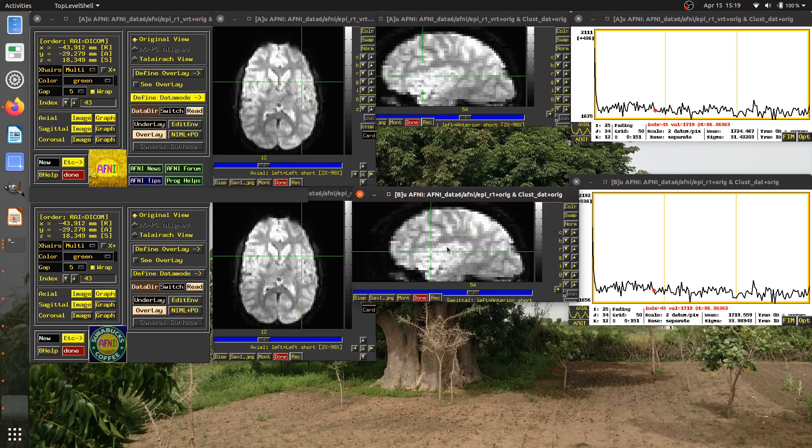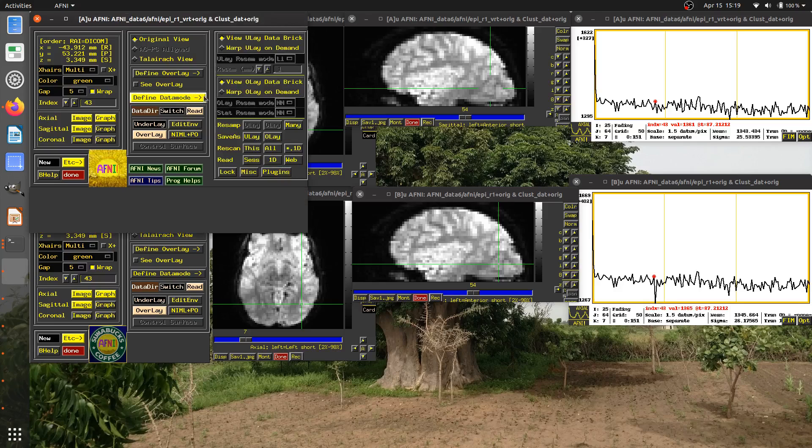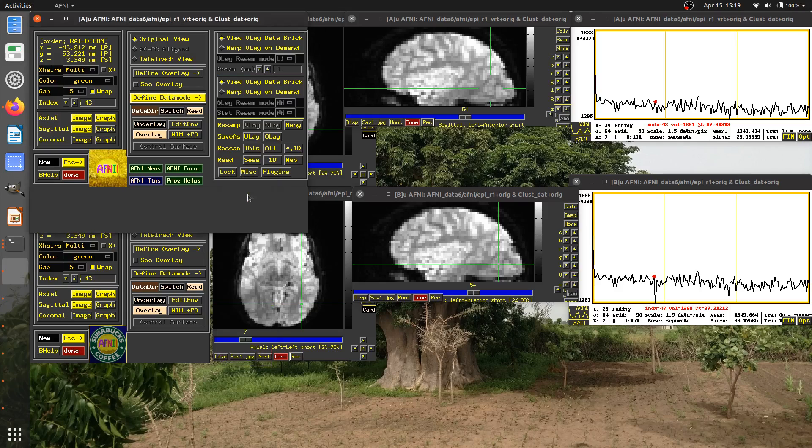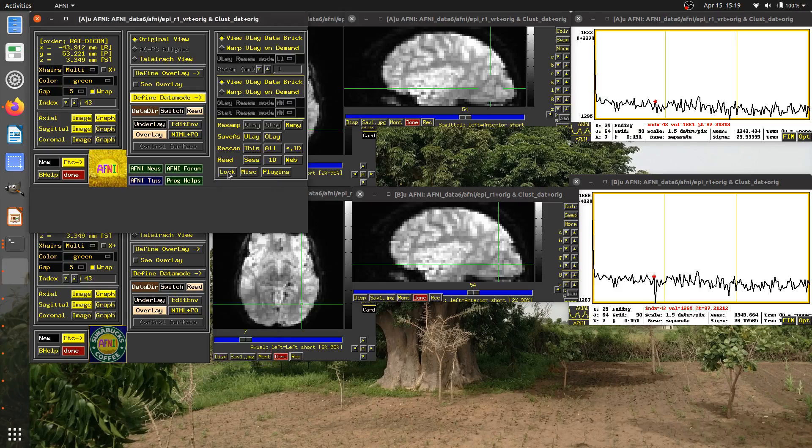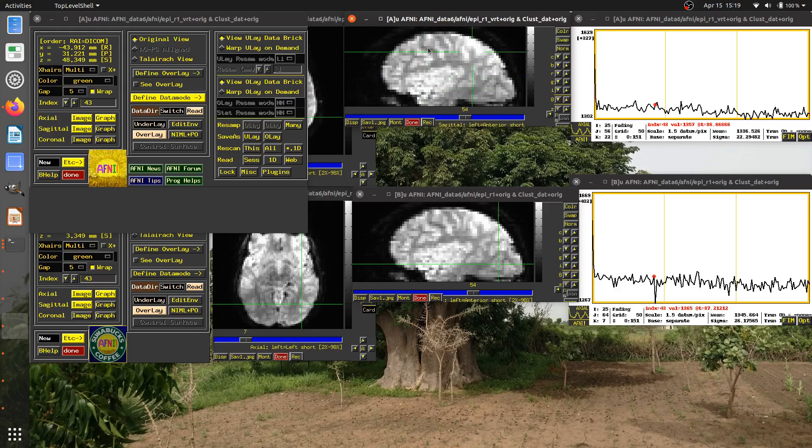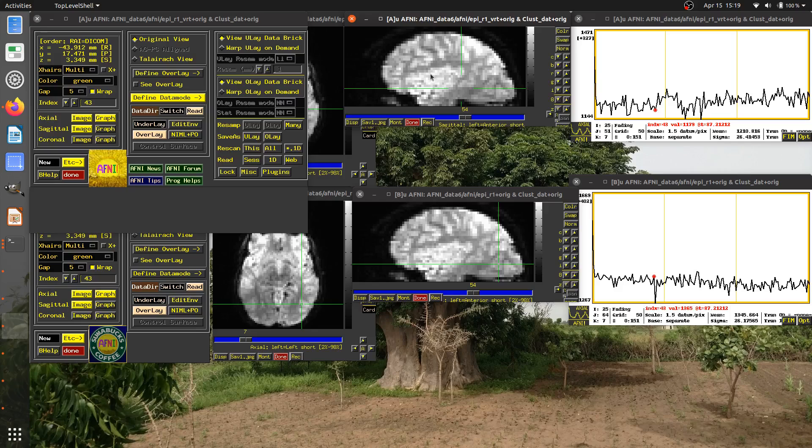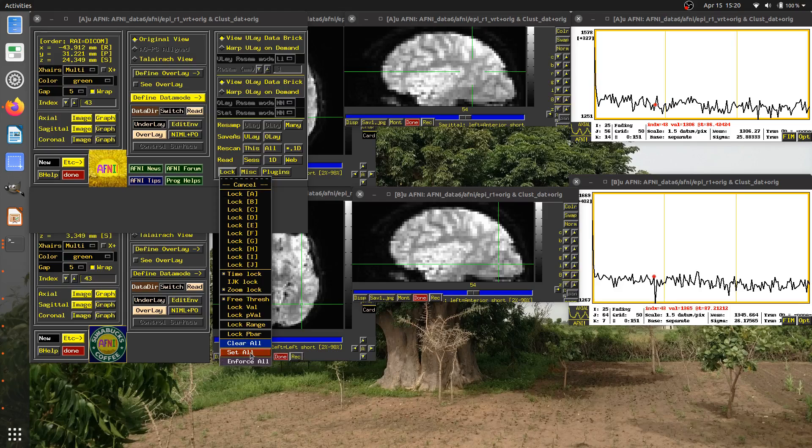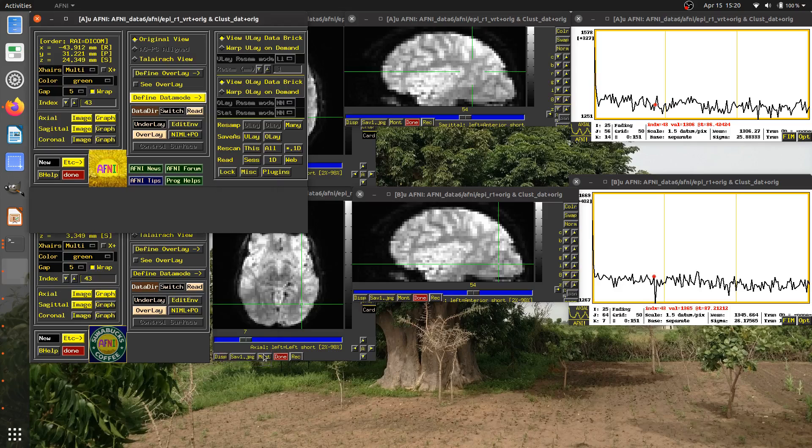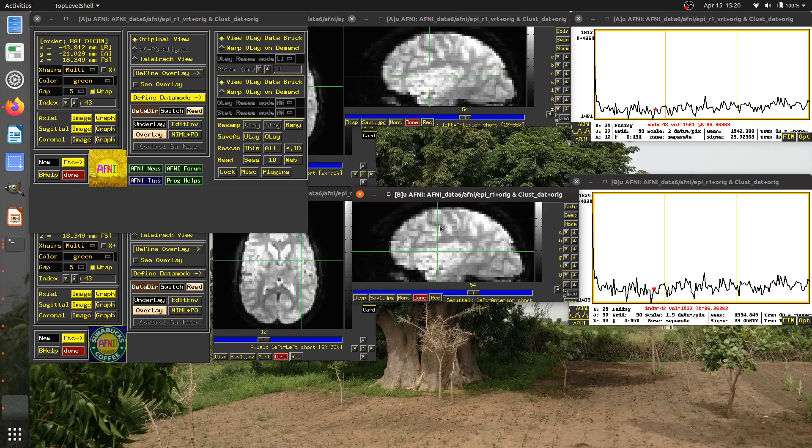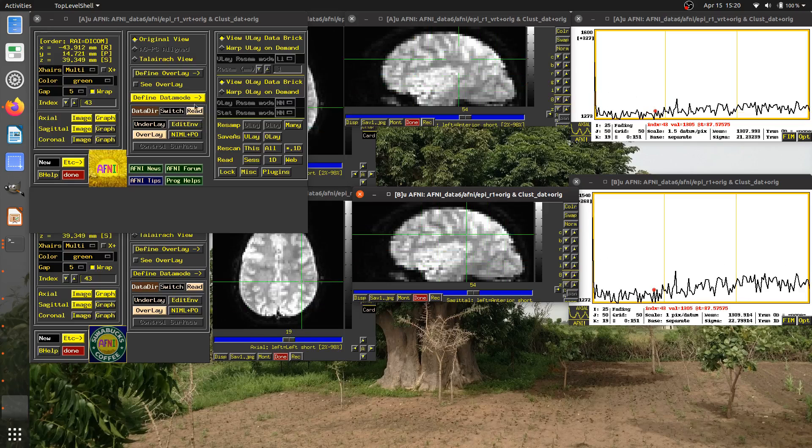If I wanted to do something like turn off the spatial locking here, I could go to define data mode, lock. And if you notice here, these are all the spatial locks for however many controllers up to the Jth controller I have. If I click on this one now, you'll notice they're all unlocked. And if I click now in this dataset, you see the crosshairs are moving in this dataset. They're no longer locked together. So if you want to unlock spatially, that's how you can do it. I'm going to go back to lock and down here, select set all because I want all the controllers locked spatially.